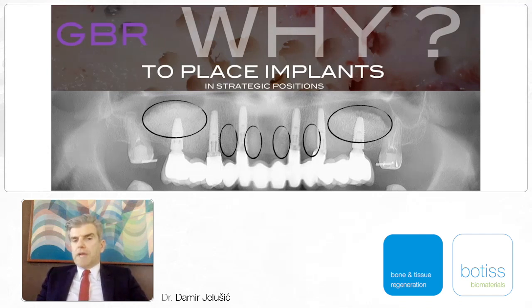So during the same surgery: bilateral sinus lift, extraction of teeth, implant placement, and preservation of the whole ridge using biomaterials, which are again very stable, which will give us long-term, or let's say lifetime, stability in terms of volume, etc.